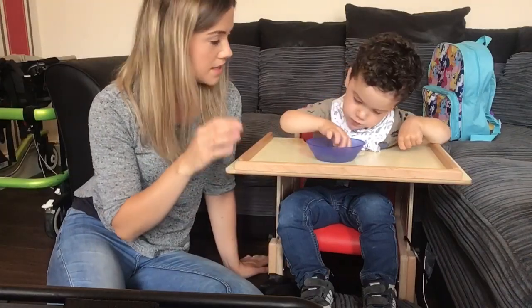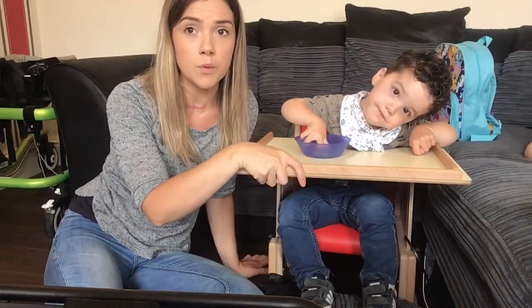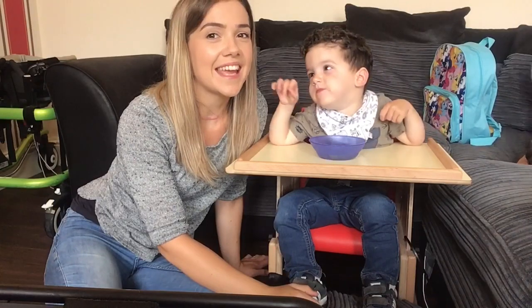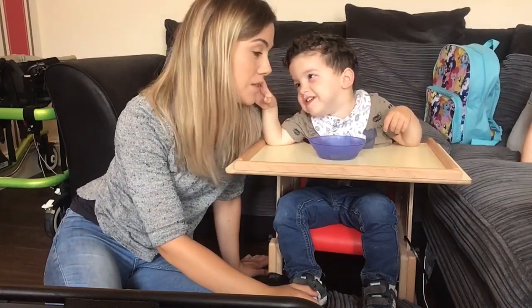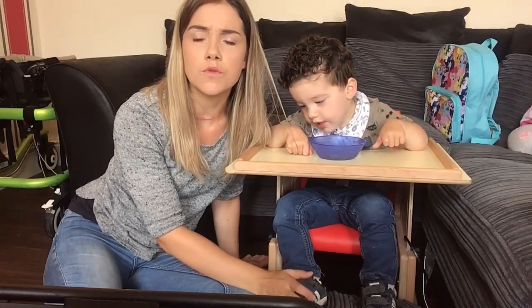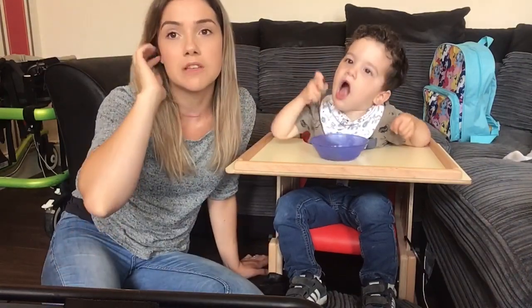Now it comes with extras — the chair itself is sold separately. You can buy a table and you can buy a footrest. We were lucky enough to get this on the NHS, so an occupational therapist got this for us. I think it's normally the go-to chair for the NHS because it's quite a cheaper option as far as special needs products go — I know nothing is cheap.